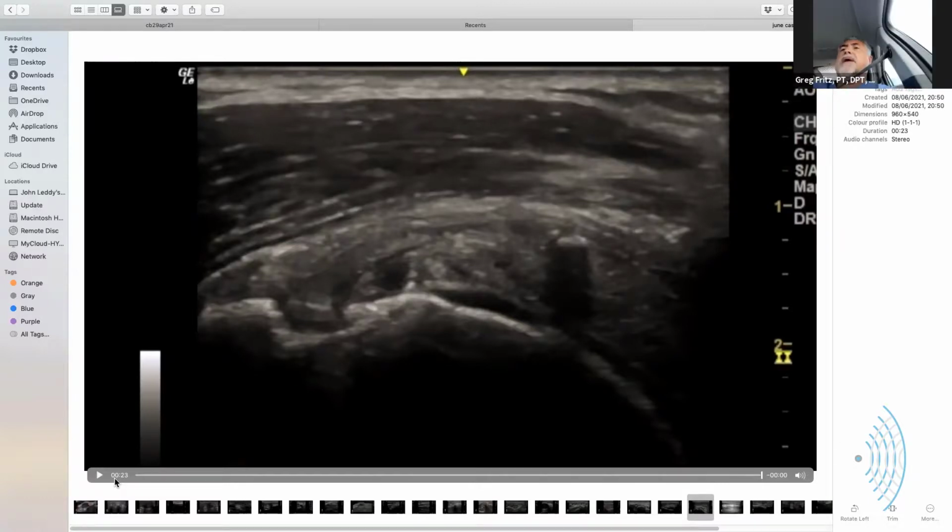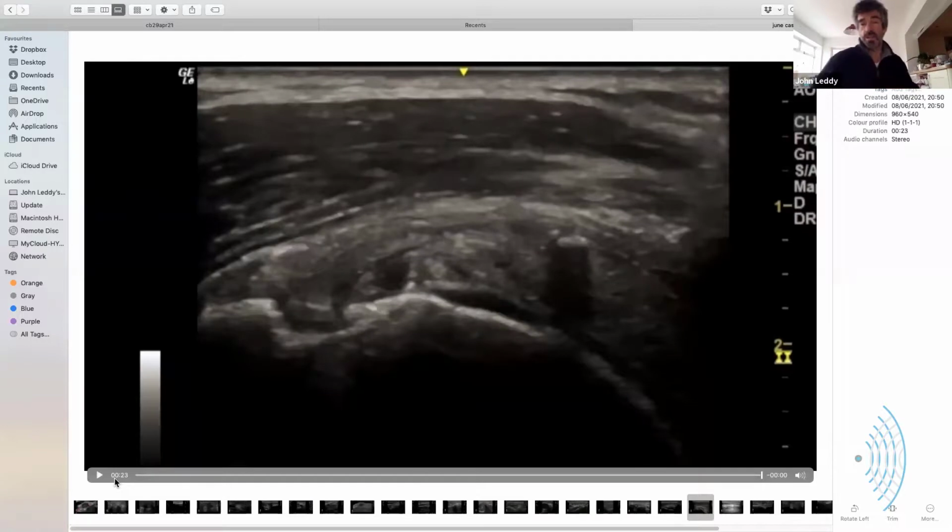I look at supraspinatus there as well if I wanted, on a bit of a stretch, but mostly some acromions just get in the way, and you can see a bit more of infraspinatus if you roll them round. So that's how I look at it. Where there's a big tear in supraspinatus, the head comes up a bit, and then I'm looking at infraspinatus with the arm in this position, just because it draws it down and out from under the acromion.